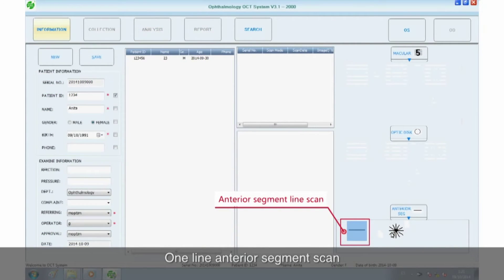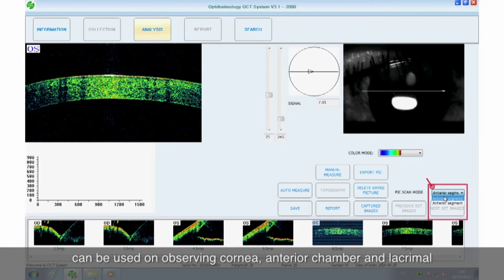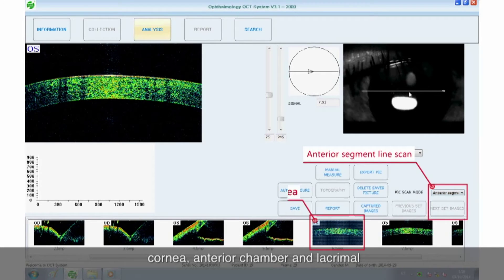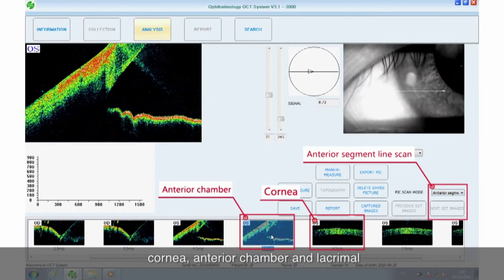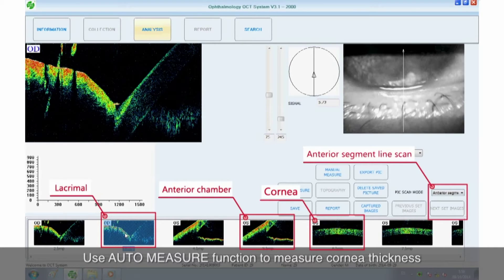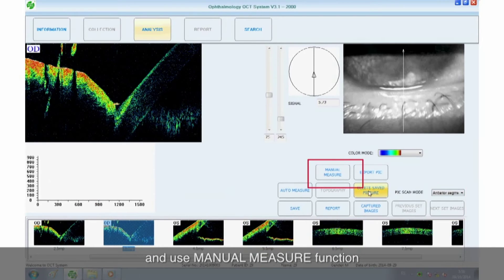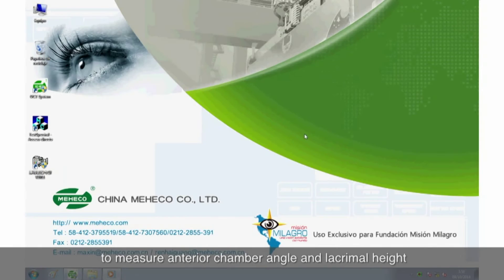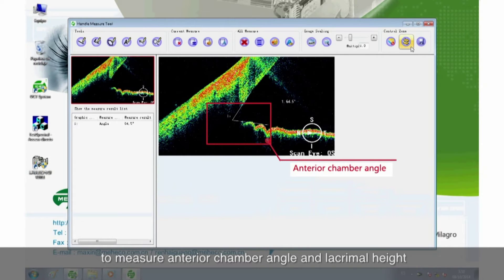One line anterior segment scan can be used on observing cornea, anterior chamber and lacrimal. Use auto measure function to measure cornea thickness and use manual measure function to measure anterior chamber angle and lacrimal height.